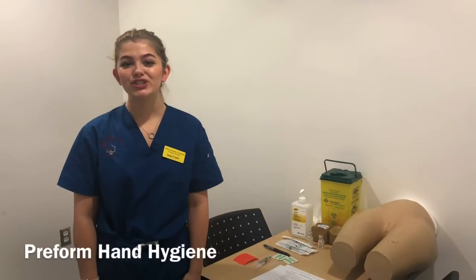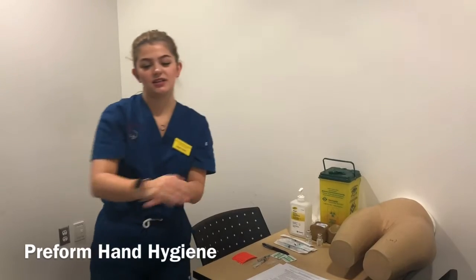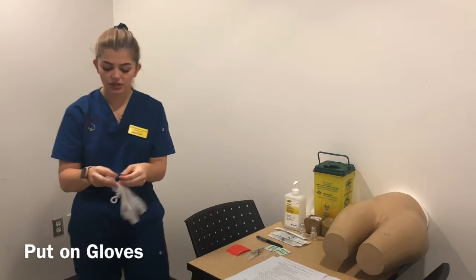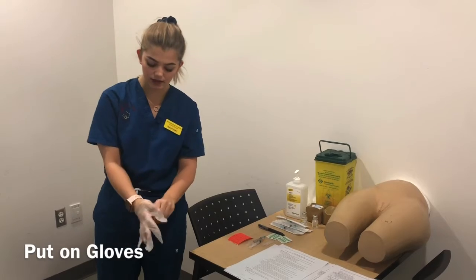Okay. So I'm just going to perform hand hygiene before I inject Mr. Mancini with the medication. Going to make sure I put on gloves. So this is not a sterile procedure. You just need regular gloves.